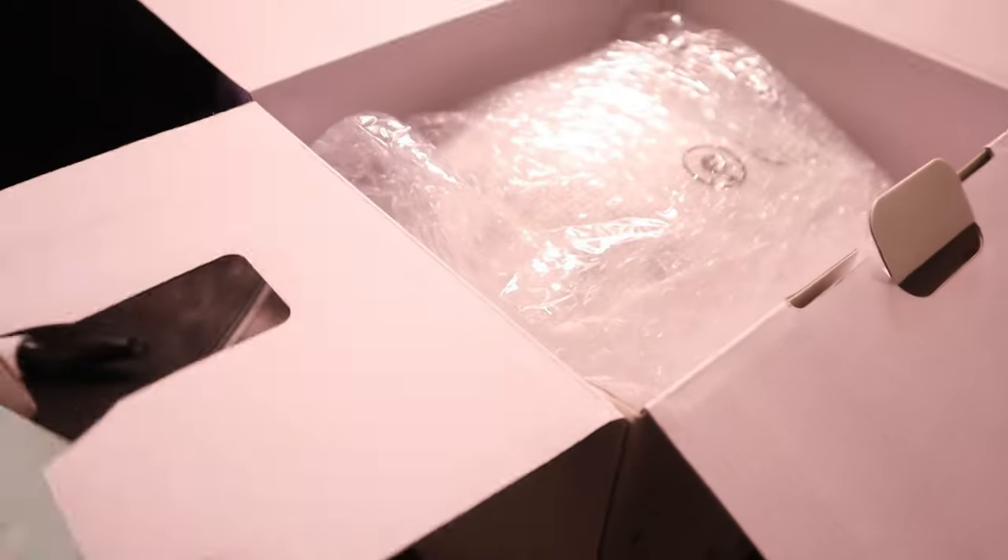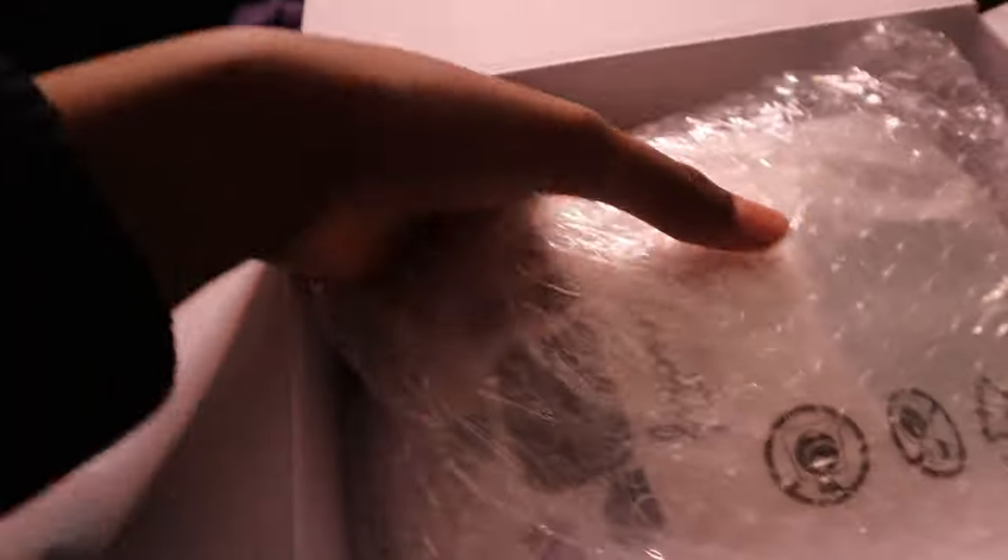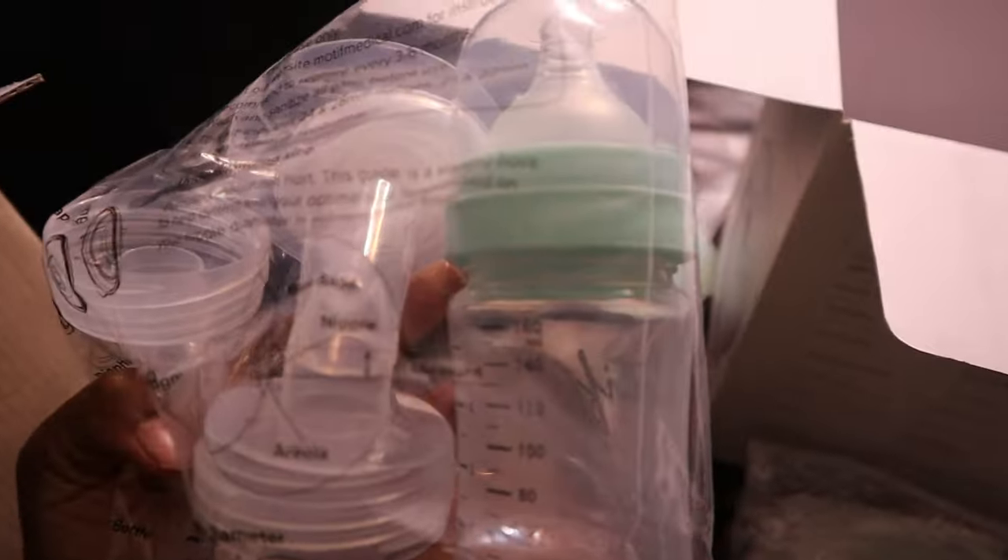So we got these — here's the breast pump. It comes with two bottles too, and this is the plug. I'm gonna try it out, I'm gonna use it, and I'm 100% honest — I'm gonna tell you if it's a hit or if it's not. They got a lot of good reviews like I said, but yeah, I'm gonna try it out.